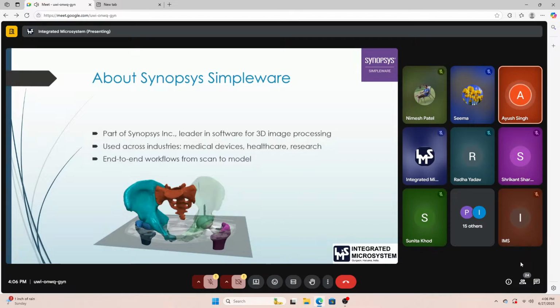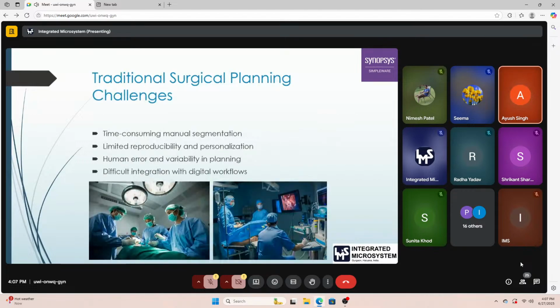It's applicable in a wider range of applications because we not only cater to medical applications, but it also has its advantage in any sort of material reverse engineering. But since this particular session is much more focused on the medical aspects of the tool, I shall be focusing on that. The tools used in medical image processing are basically the same tools used for material research also. So we have full coverage within our Simpleware range.